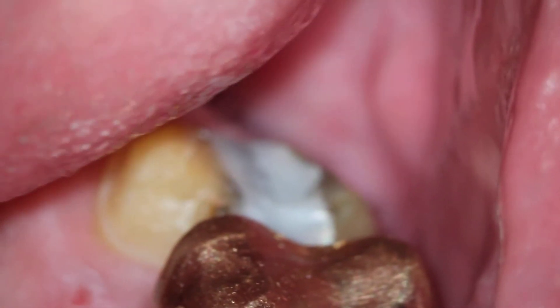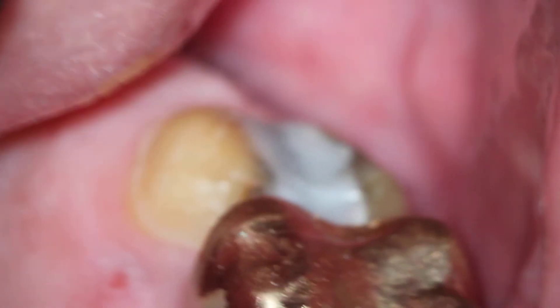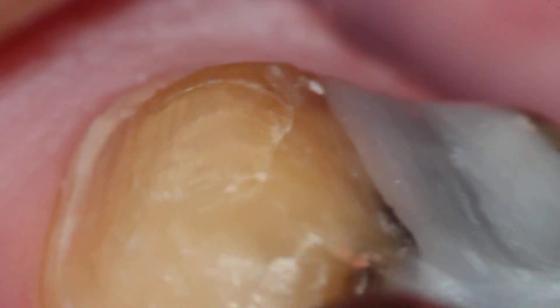High magnification ranging between six power and about 18 power — just switching up to eight — there we are at about 22 power magnification. Very cool.